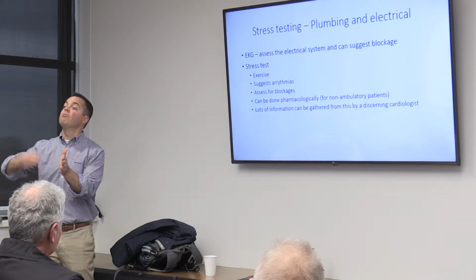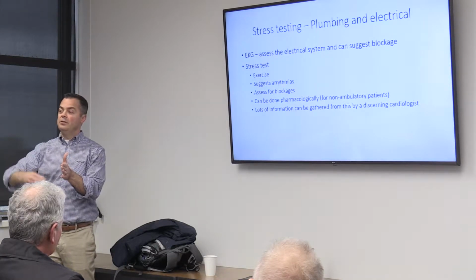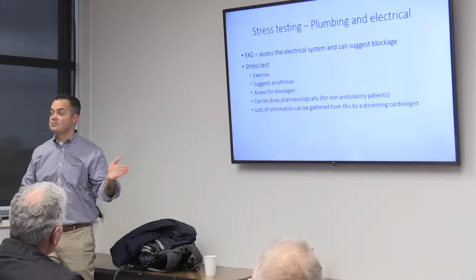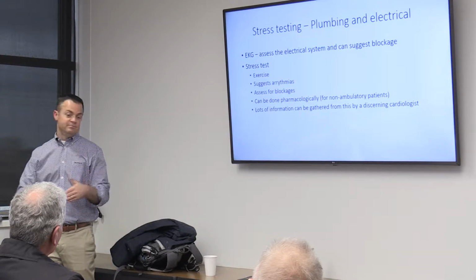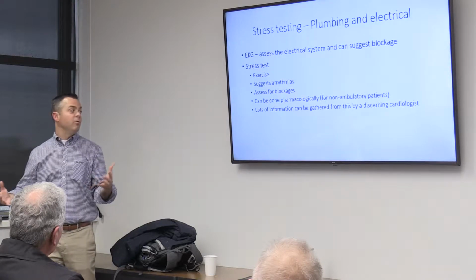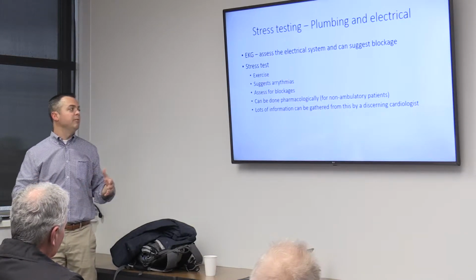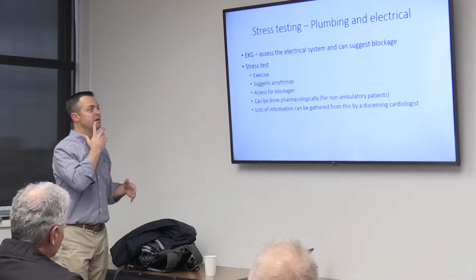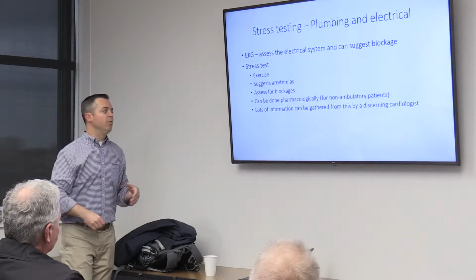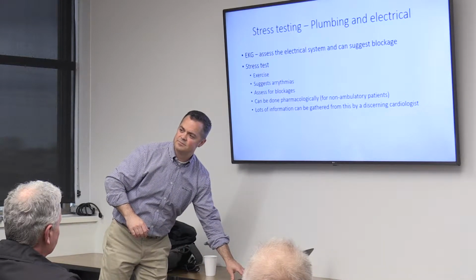And we can actually measure how far you can go on a treadmill. So we'll push you as far as you can go. And they'll say, well, how far did I go in 2012? And I'll say 12 mets. And then they'll say, well, how did I do this time? 13 mets. You know, they like that, okay? So it can be used to monitor how a patient's doing clinically over time. But again, mostly looking for blockage disease, and you don't want to leave any of the data behind. Use it all. Any questions about stress tests?